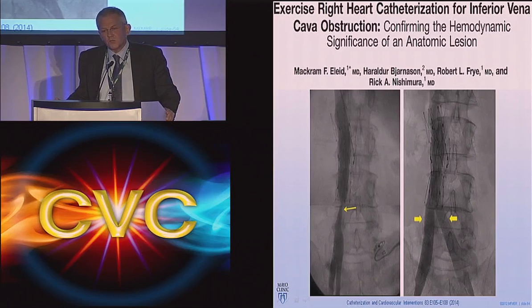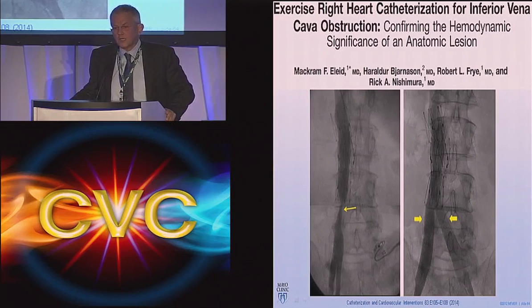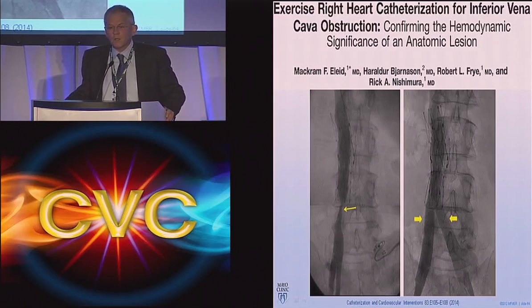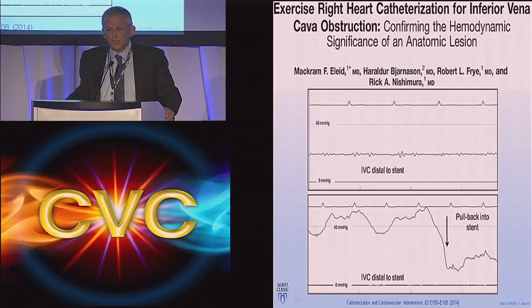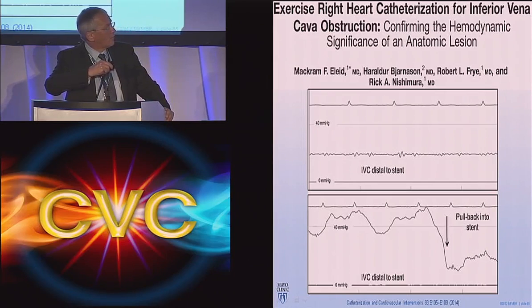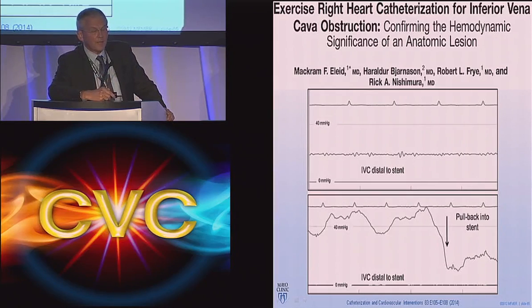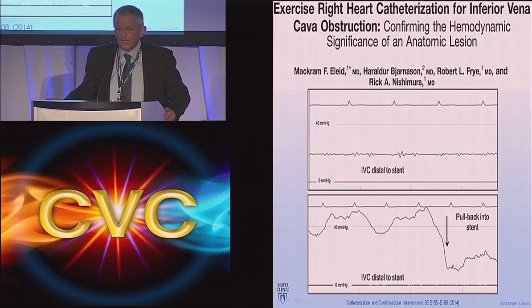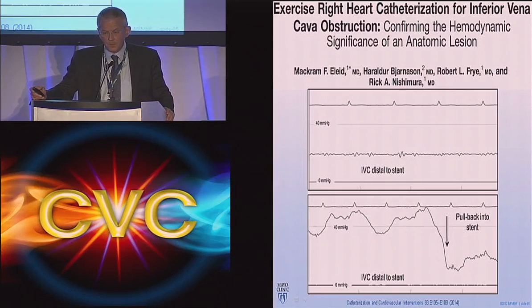He then presented with shortness of breath and was not feeling well, and did undergo a right heart catheterization from a jugular vein approach. They have the patient on the table with a bicycle, so they are lying flat but have a bicycle. They placed the catheter distal to the obstruction that you can see on the right side here, actually on your left side, and found that the upper one is the pressure gauge before they started having the patient bike, and then now with the pressure gauge below the stenosis and the patient biking, and then they pull the catheter back, and you can see that by increasing the blood flow you can increase the pressure measurements. We are guessing that this may help us in determining what is a hemodynamically significant stenosis and what is not, and we are planning on doing an evaluation of that.